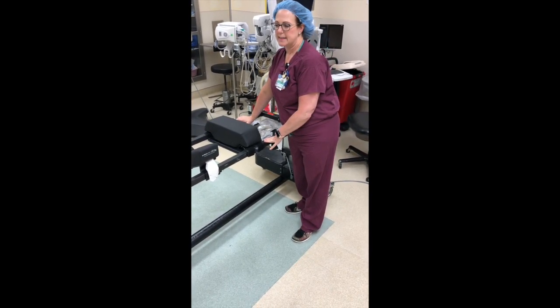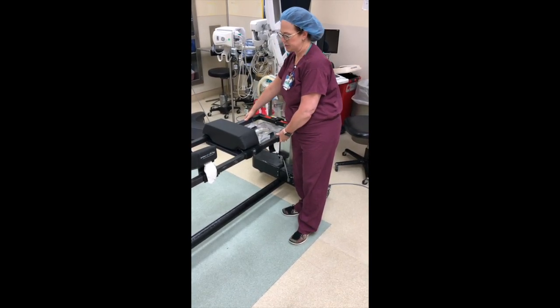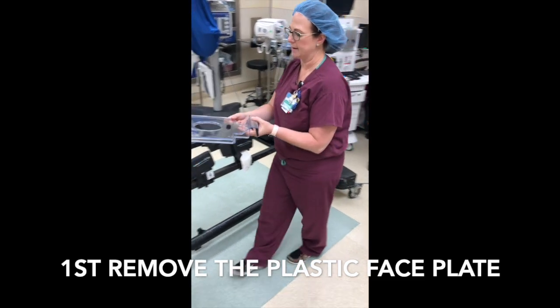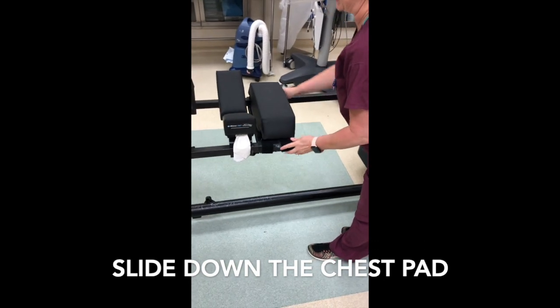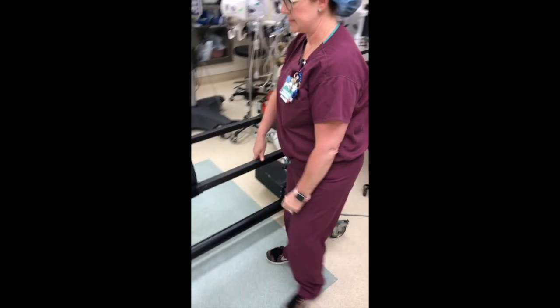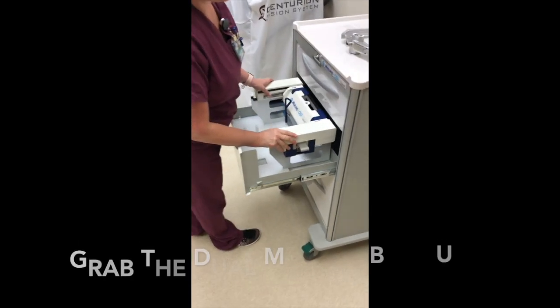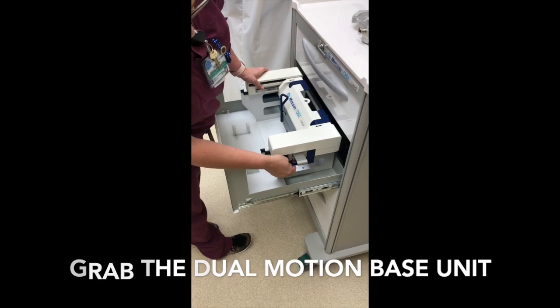To use the Laveau headrest, you have to make some changes to your table. First, you'll remove the plastic faceplate and then relocate the chest pad and move it down. Then you're going to remove your base unit from the second drawer of the Laveau cart.